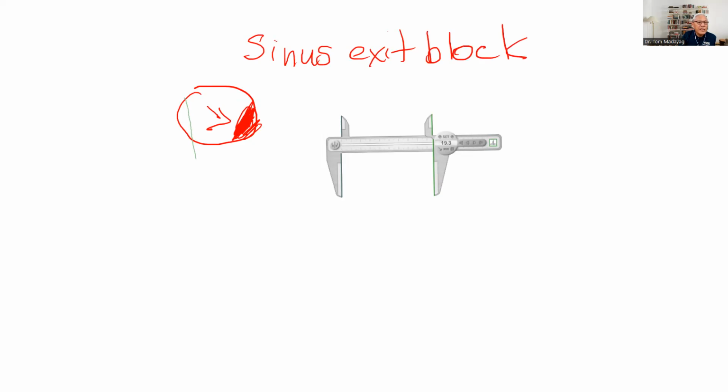Remember now that in a sinus exit block, the sinus node continuously works. However, there are some instances wherein the impulse is blocked from getting out of the sinus node. In a sinus arrest, the sinus node just decides to stop. And that's exactly the description of what is known as a sinus arrest.